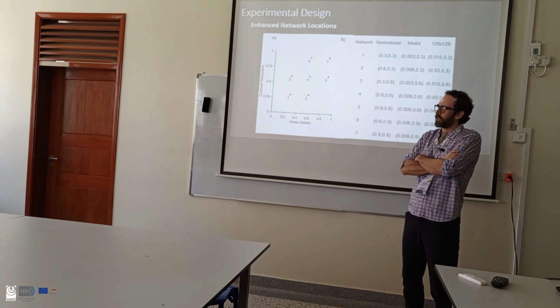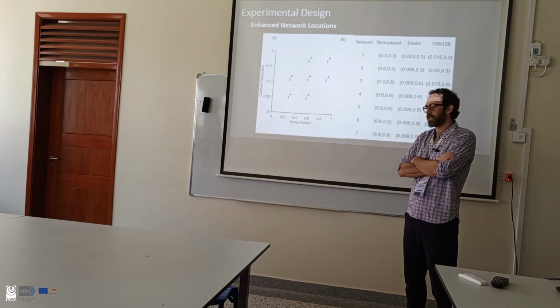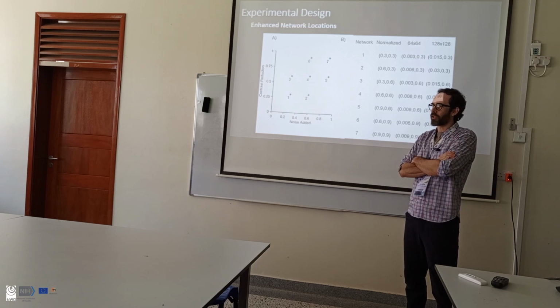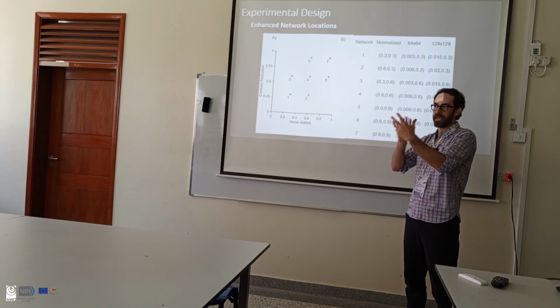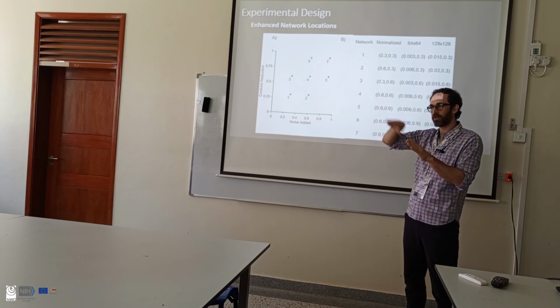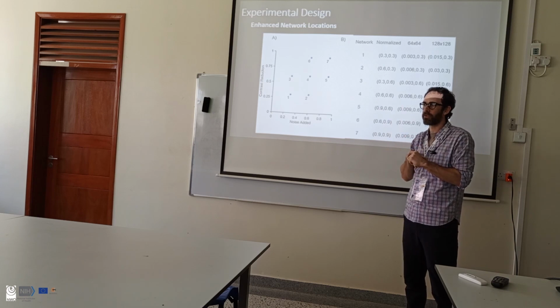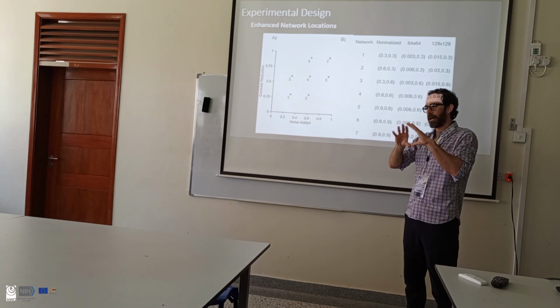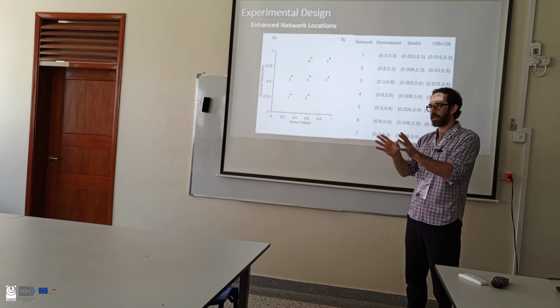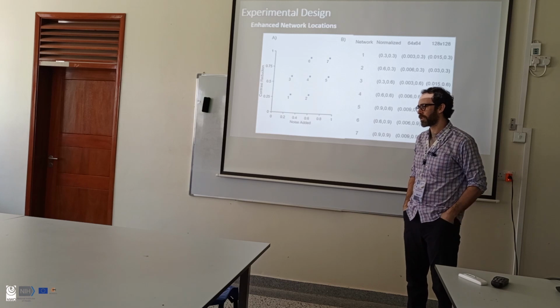I wouldn't say that. Anybody can correct me if I'm wrong, but I wouldn't necessarily say that the noise has any relationship with the contrast that you can produce. My view was, let's explore this space of contrast and noise combinations and see where we can handle noise and contrast reduction, see where this line between what we can use and what we can't use comes out. So I was looking at it kind of disassociated from any particular technology. I was just looking at what is actually in the image that these surgeons care about. That was my goal. Does that answer your question?